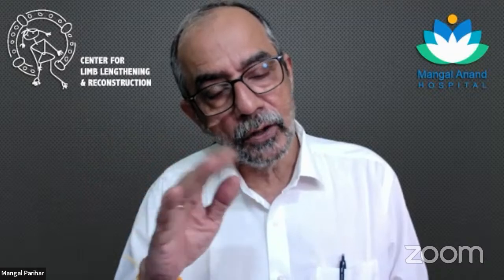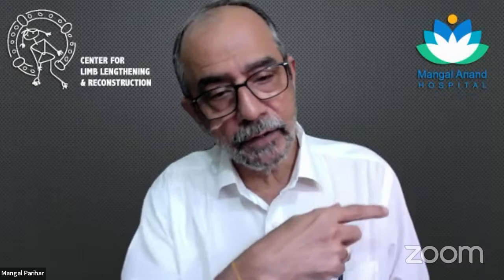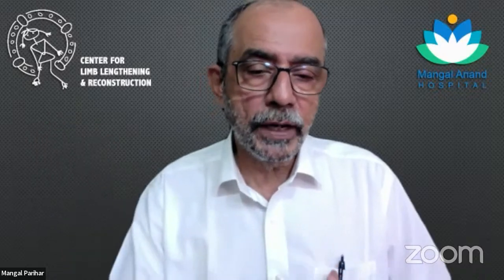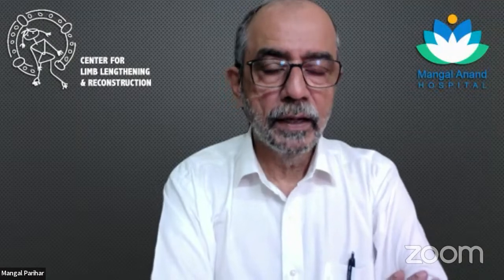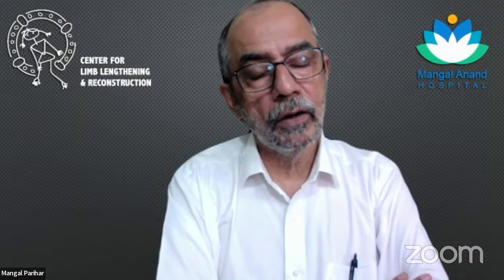Essentially, I excise all of the osteophytes. And that's what I was referring to in some of these patients. When there is a correction, an open wedge to be done, I will use those osteophytes in that gap. And those osteophytes have a phenomenal osteogenic potential, because ultimately this is new bone that is being formed over there. So it's full of all those biochemical factors. So yes, I will always look for these particular things in all of the patients.